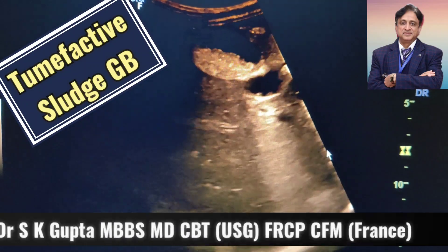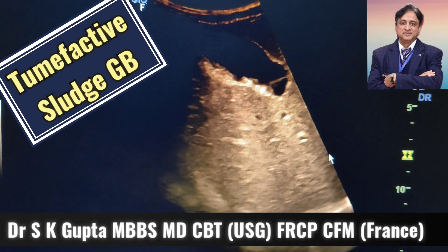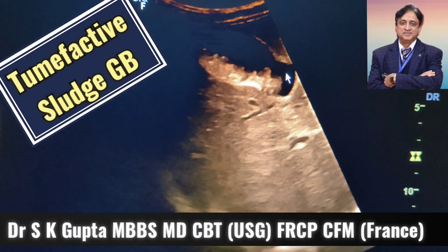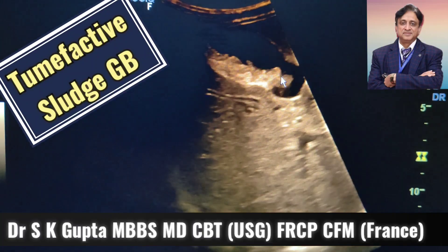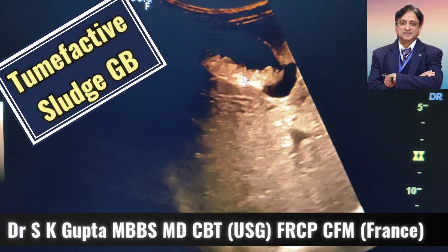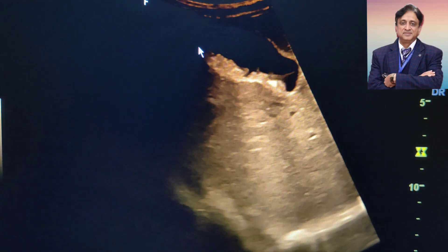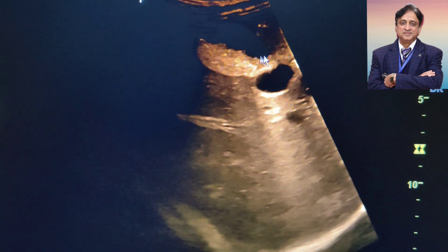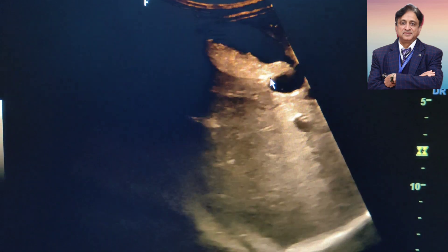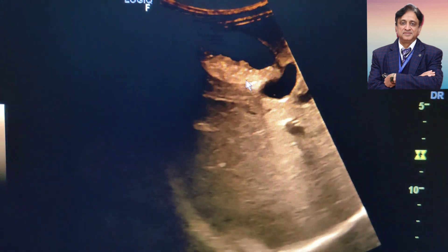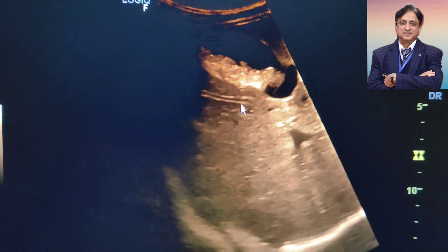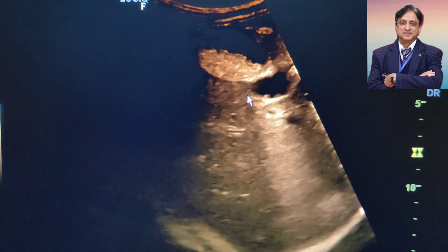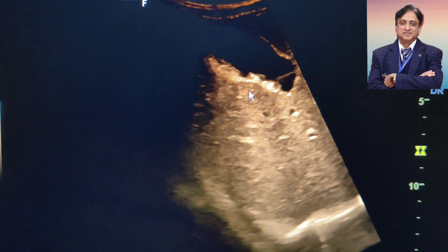Good day friends, I am Dr. A.S.K. Kukta and I am going to talk to you about the tumefactive sludge. This you can see is the gall bladder and inside the gall bladder you can see that there is an echogenic lesion, and this echogenic lesion is causing a diffuse shadowing all over here in the liver, and this is nothing but a tumefactive sludge.